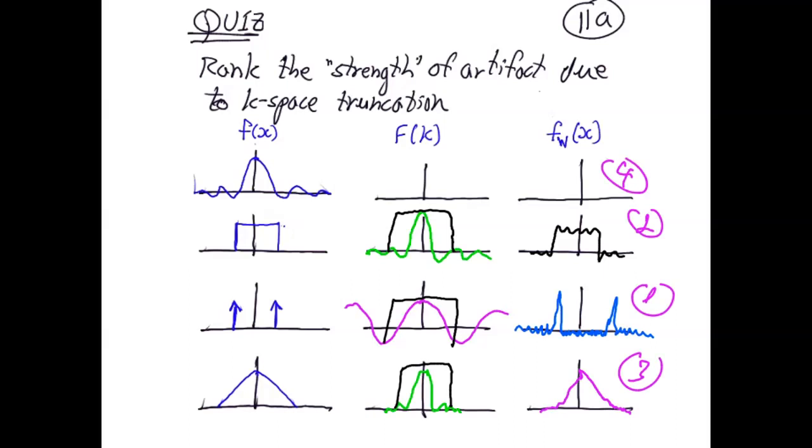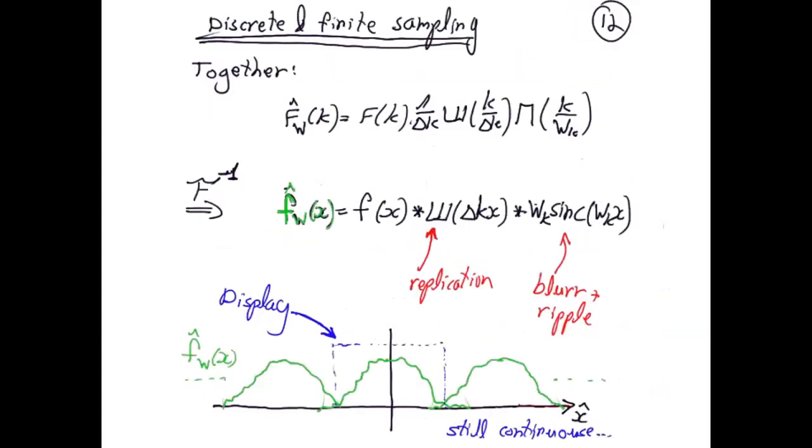Do you think truncation artifacts are a big problem in MRI? Or not a big problem? It depends. Yeah, good. Nice. Good answer. And actually, sometimes it can be a real problem. It could look like anatomy sometimes, like some problems.